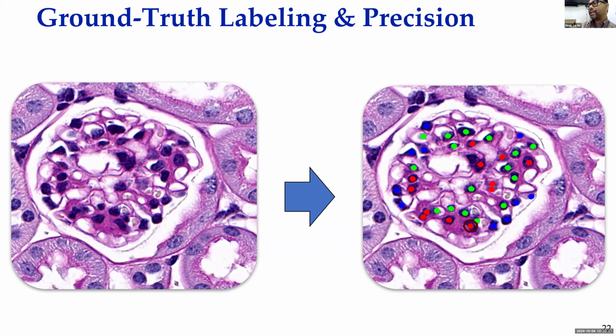But the whole point here is that in order to have that understanding, what I said in that first slide, I wanted to do that in a big data context to understand some of the hidden structure which is not even discernible by human eye, right? And think about that. In order to do that, I need this kind of ground truth data. And if I have to generate this ground truth to train my model, to ultimately teach the computer how these cell types are, this is a very difficult work, right? Because ground truth generation itself is very difficult, because you can imagine that it is a problem of precision.